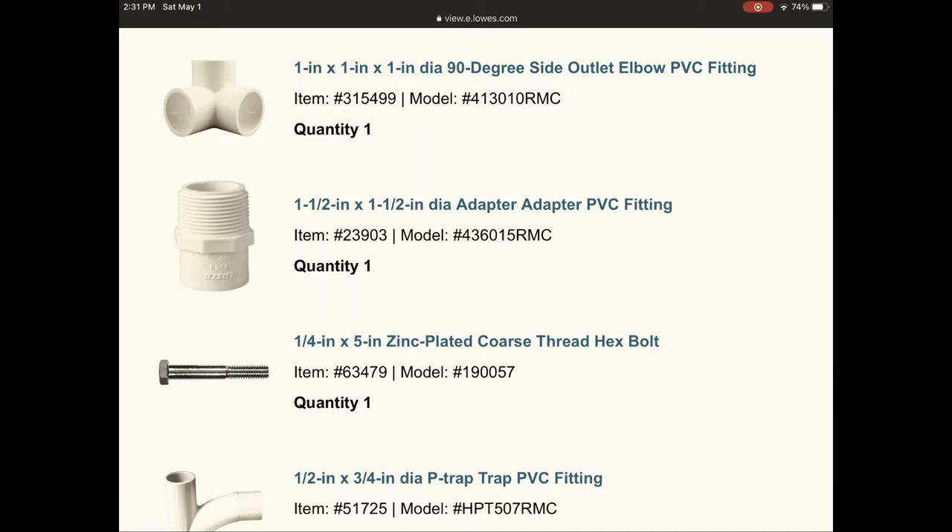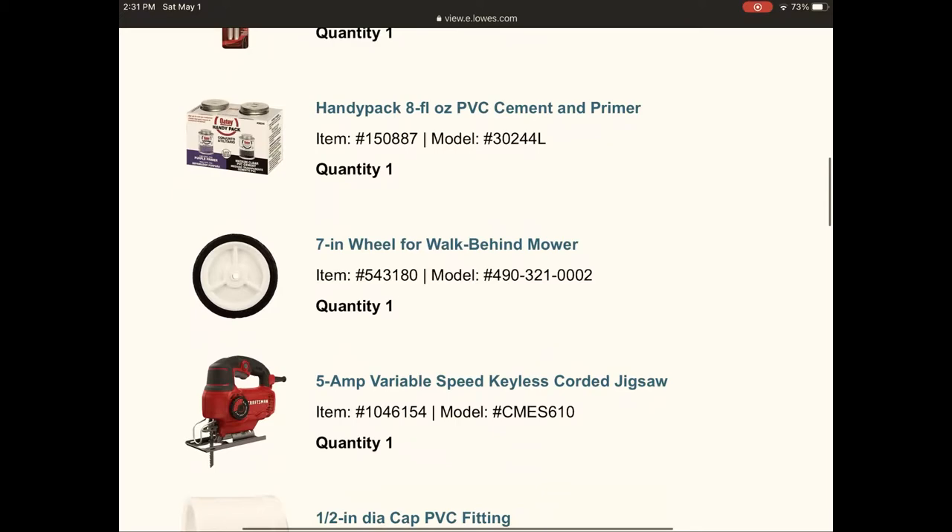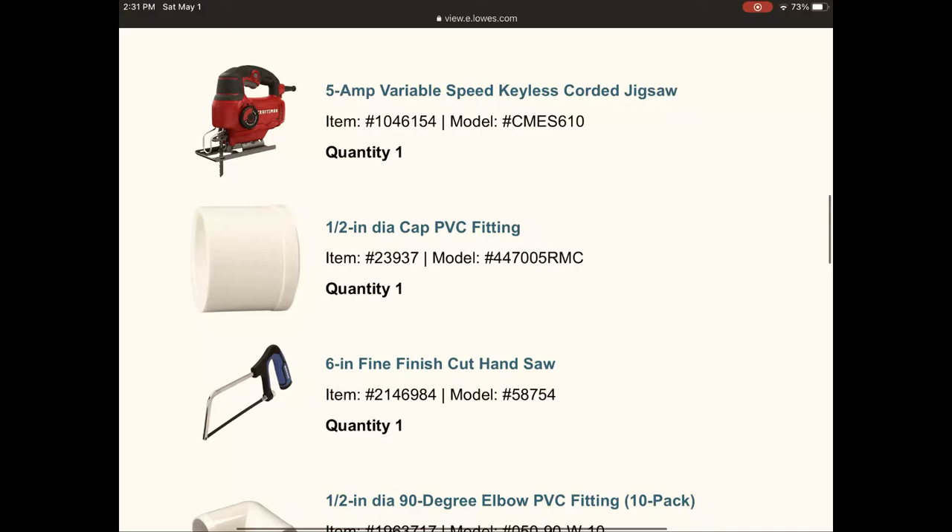This project costs roughly $100, and the mower wheels were the most expensive part — about $8 to $9 per wheel. If you found a replacement that was not only lighter but less expensive, it would definitely cut down the cost.